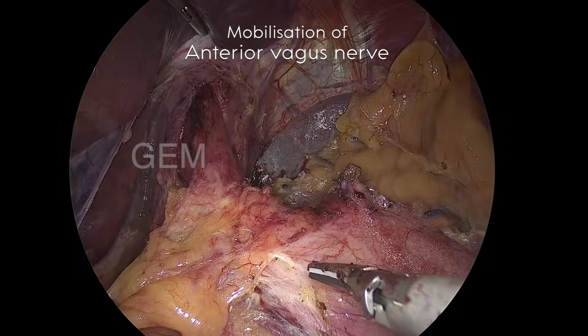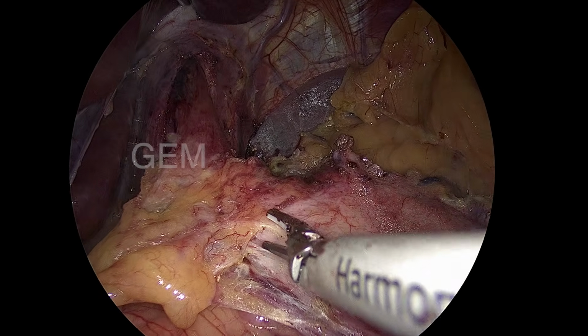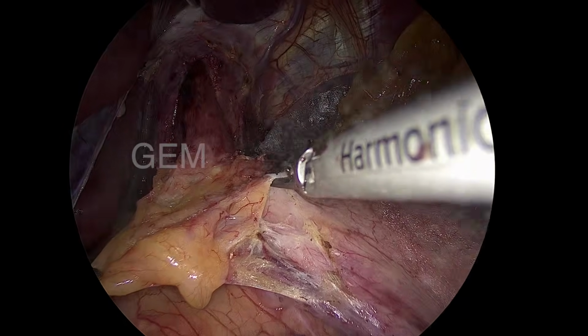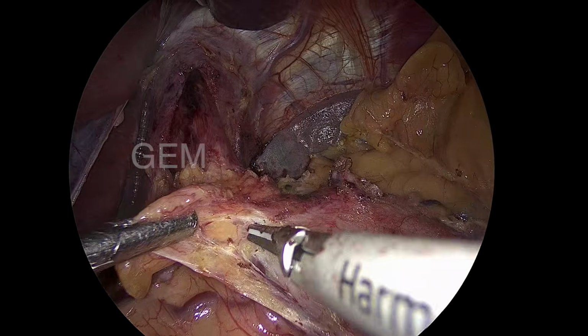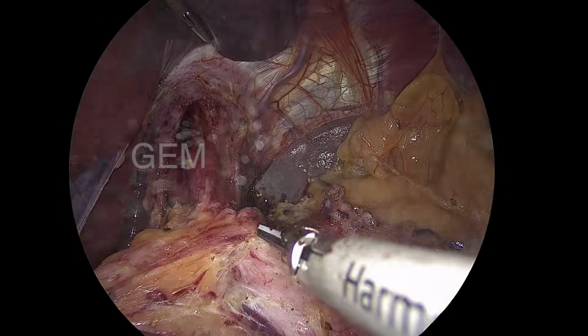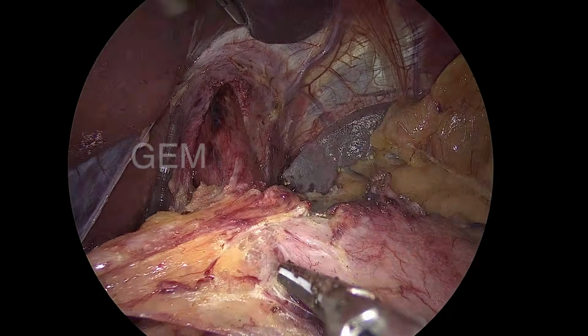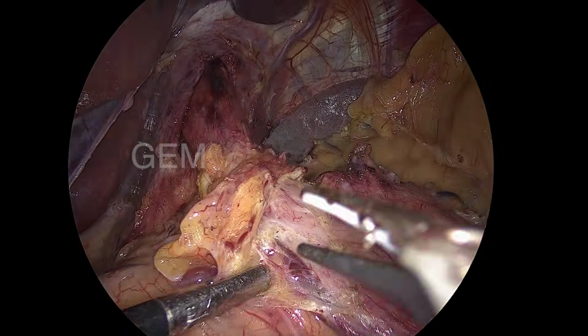So this time you can see I open one peritoneum layer covering the stomach. You can see the bare muscle. So that is very important, so that myotomy will be easier. And always dissect and then cut. It should not injure the anterior vagus, and you should not hold the anterior vagus with your left hand instrument. You can see I am holding the fat, not the vagus.